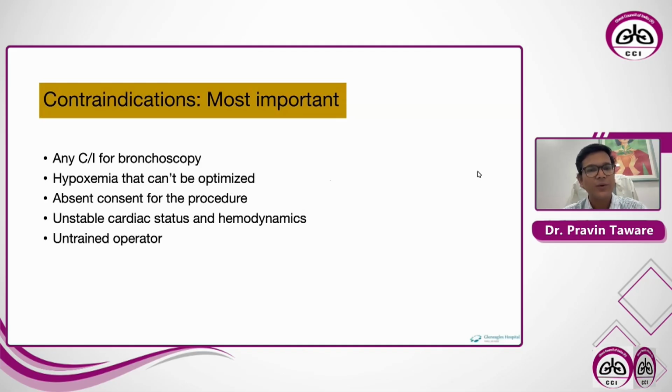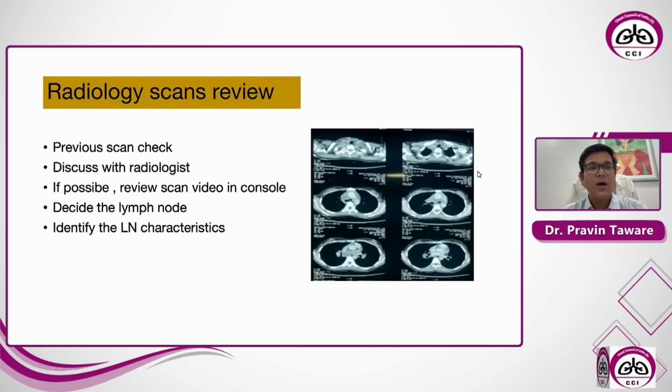Hypoxemia that can't be optimized. Absent consent: if the patient hasn't given any consent, don't proceed with the EBUS procedure. Unstable cardiac status and hemodynamics, and untrained operator. If you are not trained in EBUS enough, don't do the procedure.